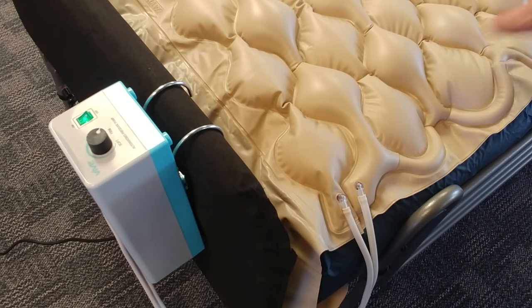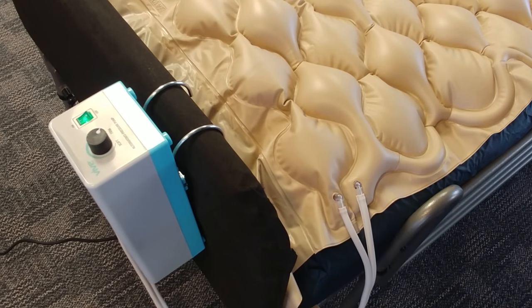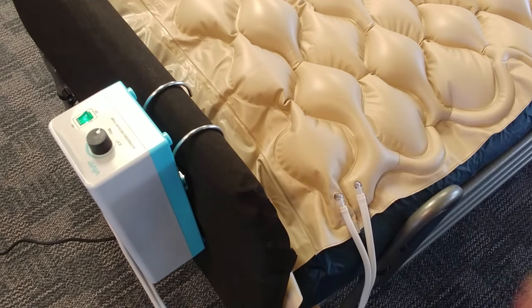The first thing you're going to want to do is lay the pad out on the bed. You'll see the air nozzle here. You generally want to put that toward the foot of the bed to make the pump more convenient to reach, whether someone is in the bed or not.